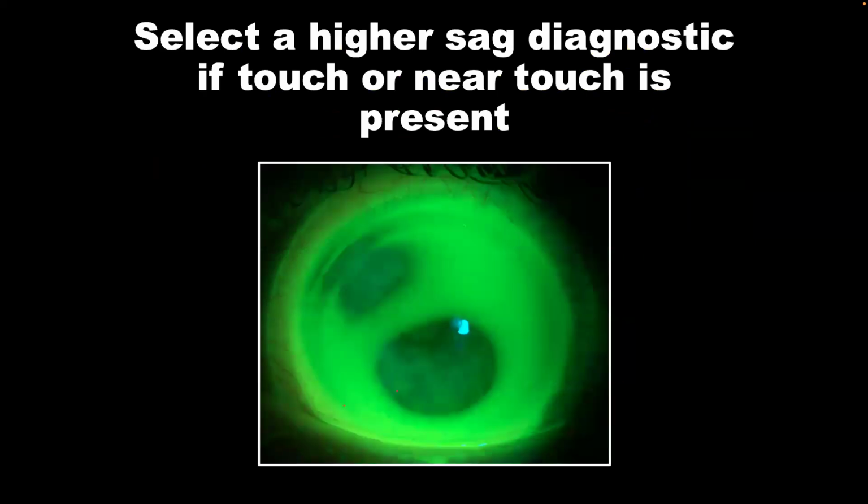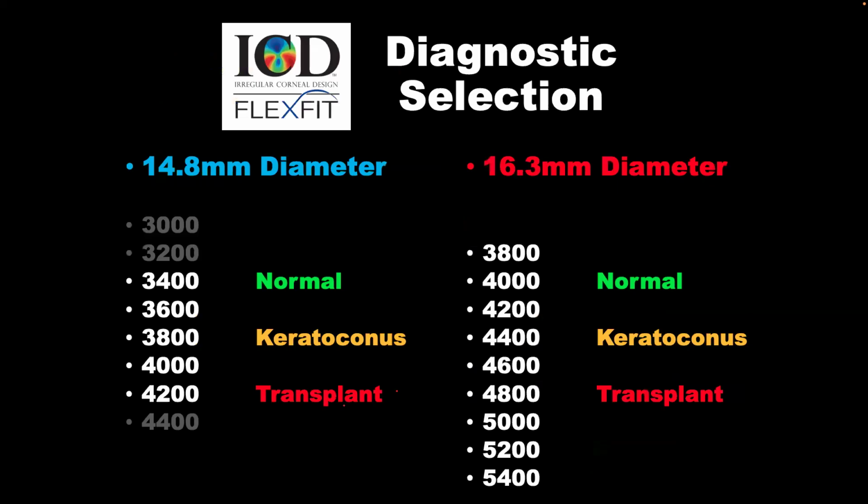This is just the basic stuff that we usually do with our patients. And as mentioned before, being an experienced scleral lens fitter, you already know much about this. Obviously, if we see something like this, the right thing to do is take it out and put on another sag. You can see here on the sag values that you can go 200 microns.